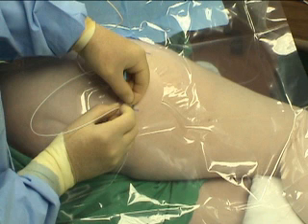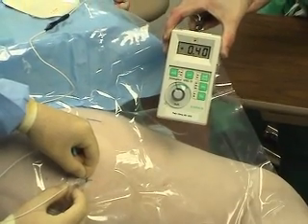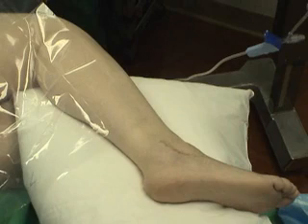Repeat this maneuver as many times as necessary to ensure correct and accurate catheter placement and successful secondary block. In this recording, it can be seen that the catheter has been advanced for at least 5 centimeters along the sciatic nerve, and the foot twitches remained brisk at a nerve stimulator output of 0.4 milliamps.